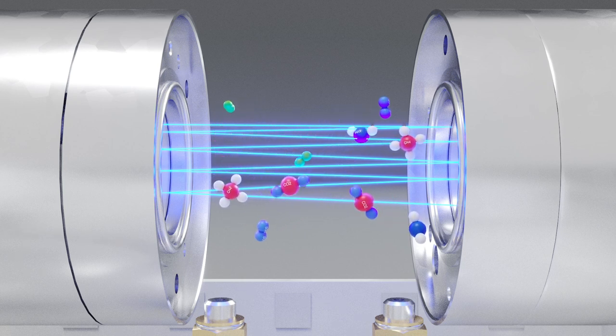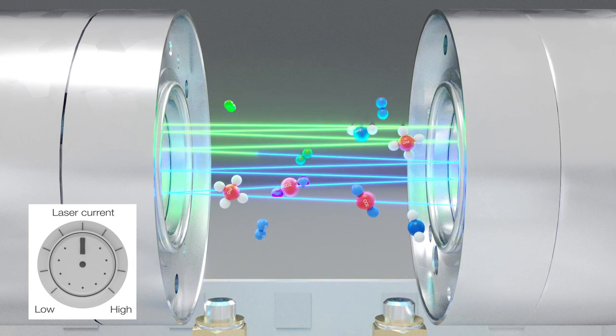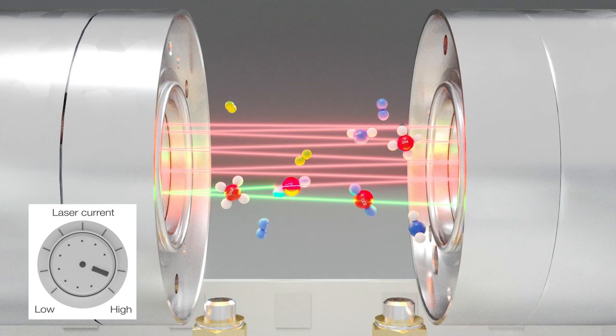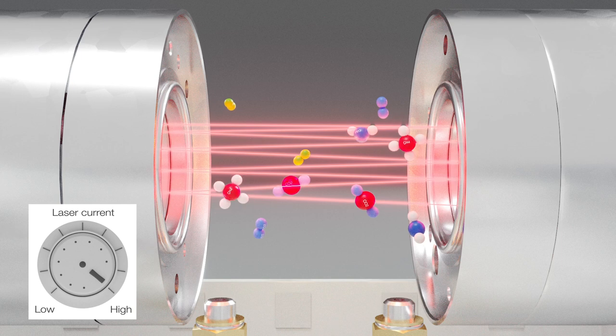In breath analysis, for example, CO2 and CH4 are relevant gases whose spectra partly overlap. Thanks to the narrow laser beam, these gases can be measured simultaneously without interference or cross-sensitivity.